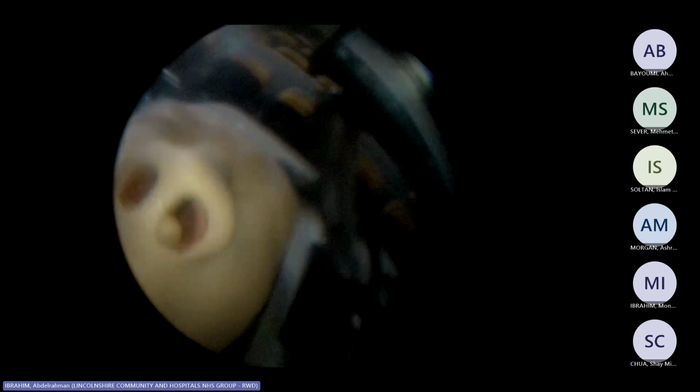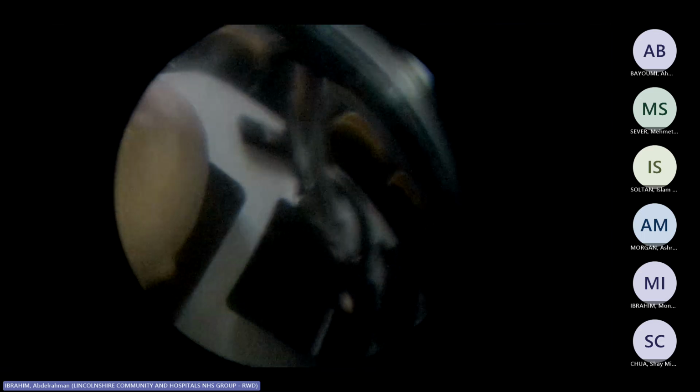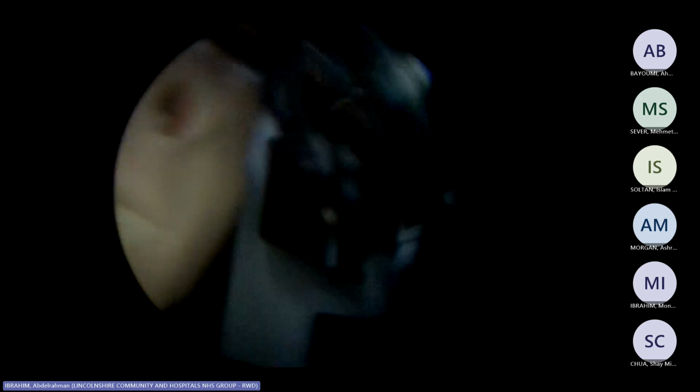Okay, so now we're going to do just the anatomy round. So it's basically, guys, again, it should be on the same angle of the eustachian tube, which is 45 degrees.